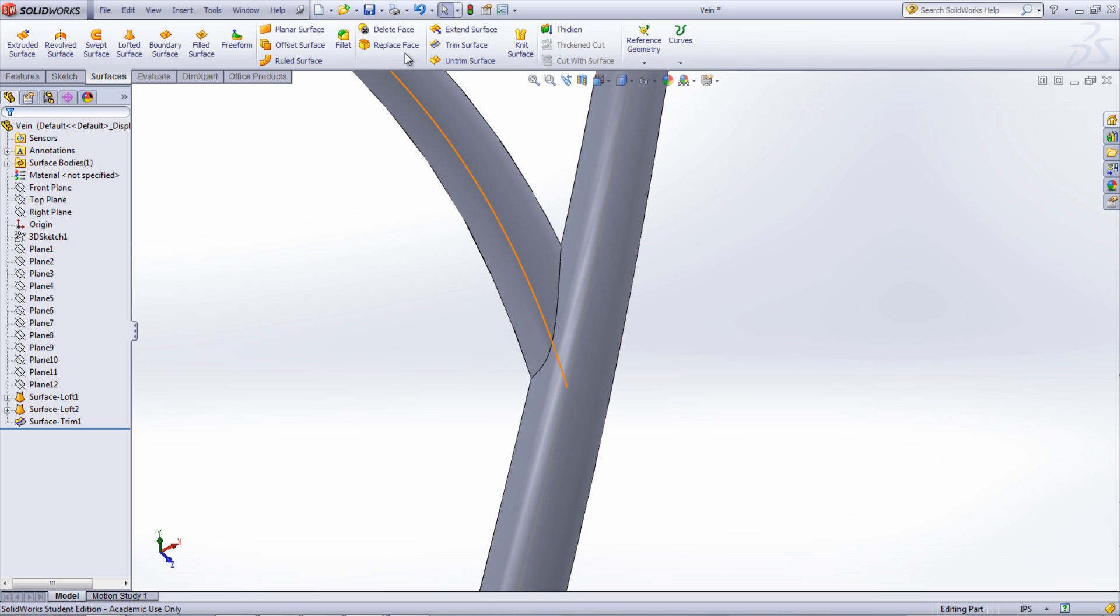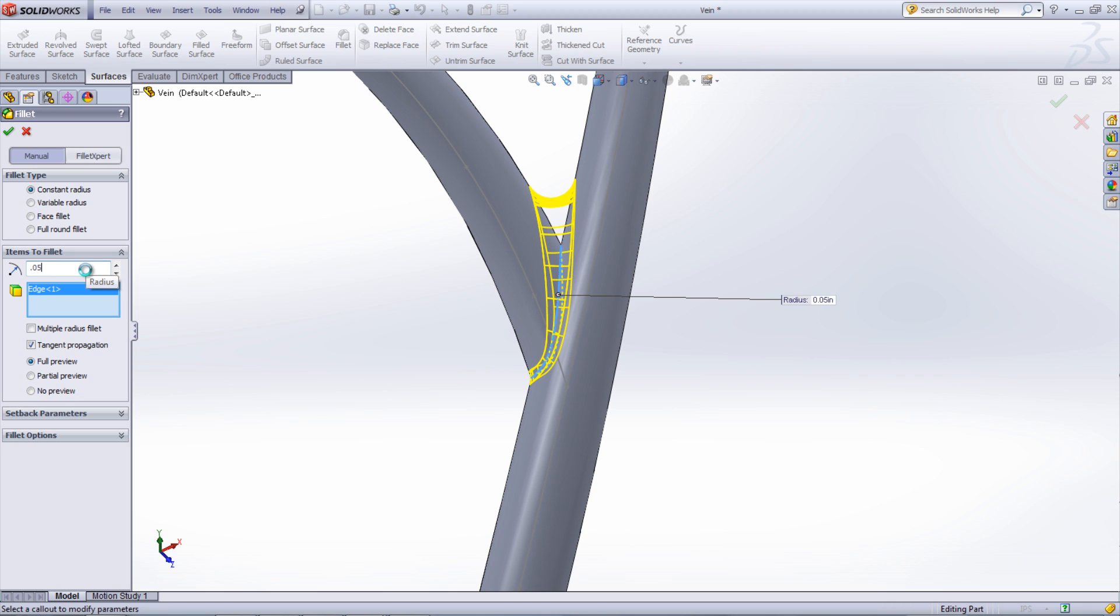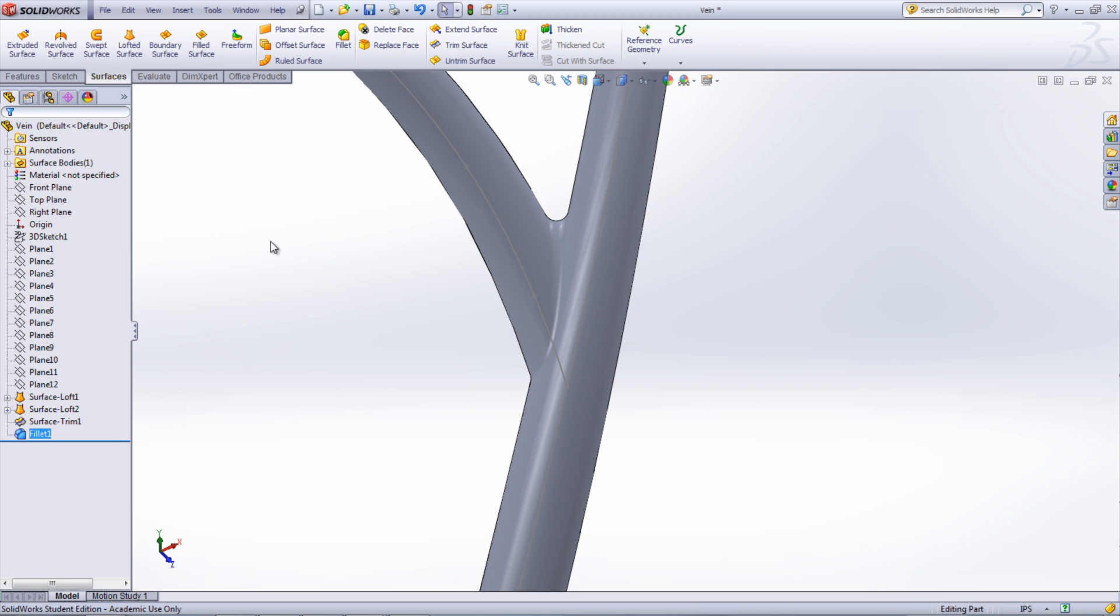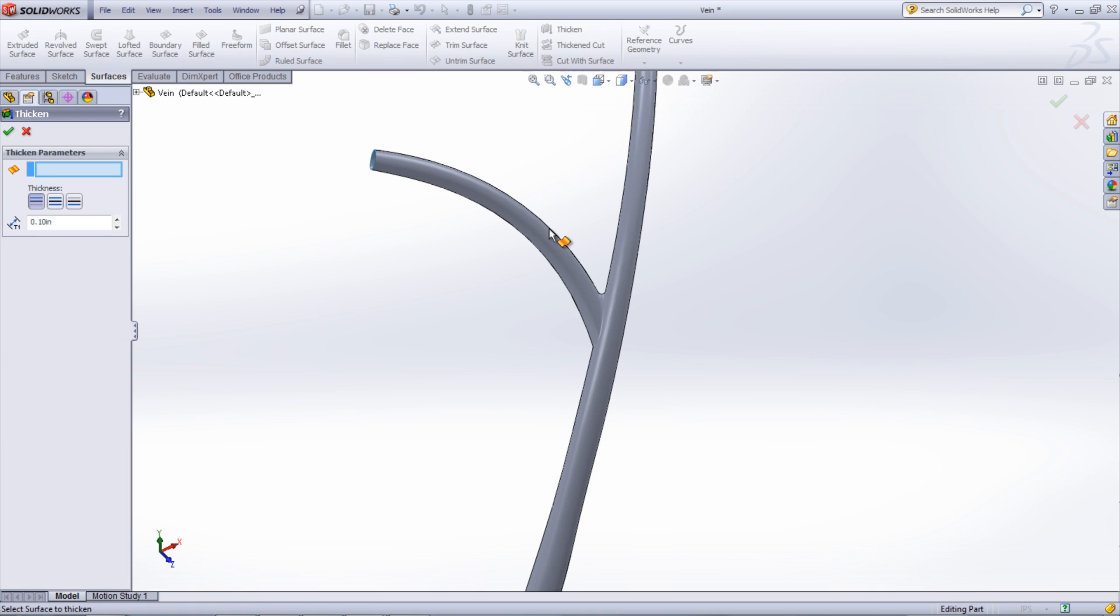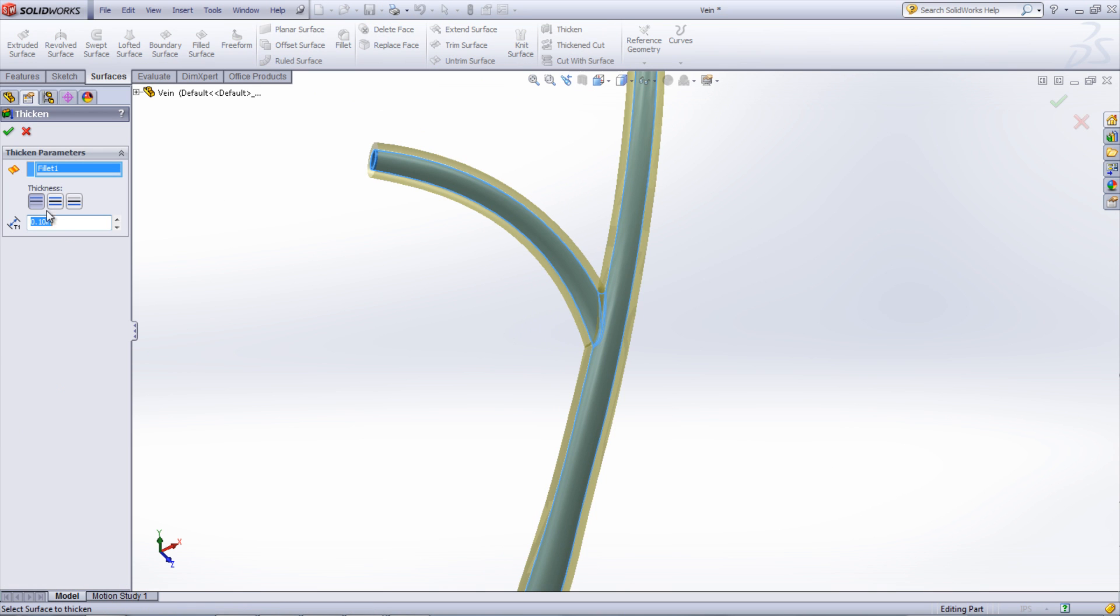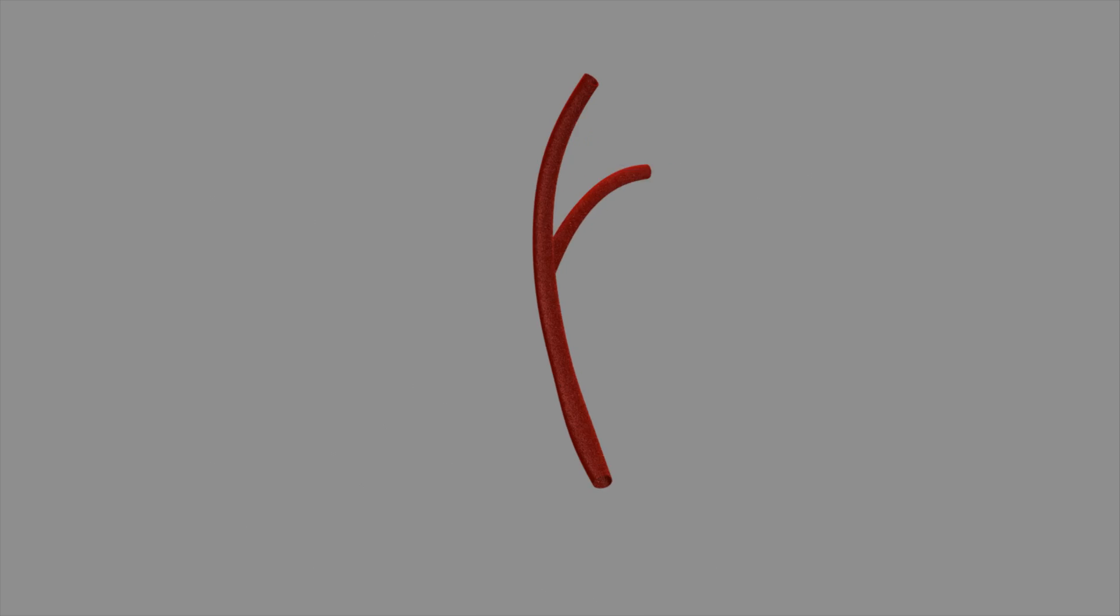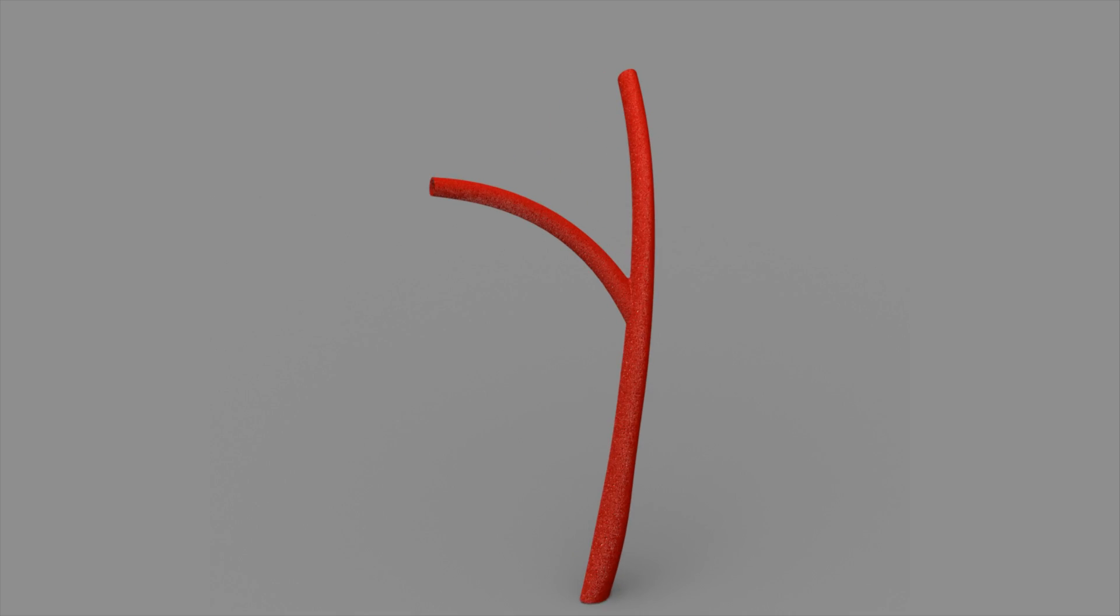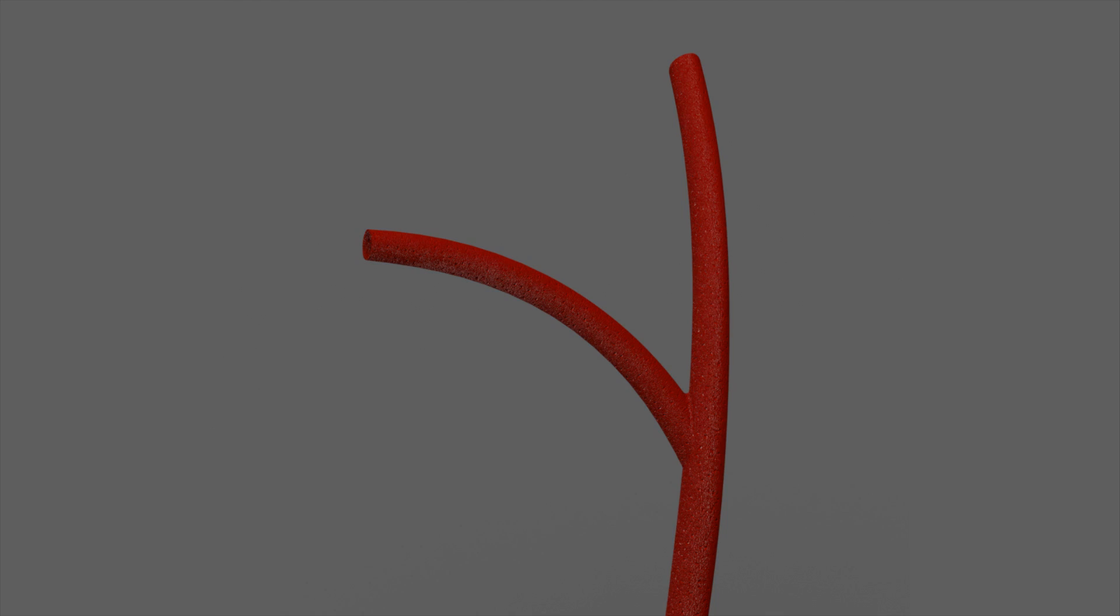A fillet can be added at that junction to give it a more natural look. Once satisfied, the thickened feature can be used to make the vein into a solid body. Select the surface and choose the direction as well as the thickness. The result of this is a realistic vein that can be used to create new medical devices and procedures.